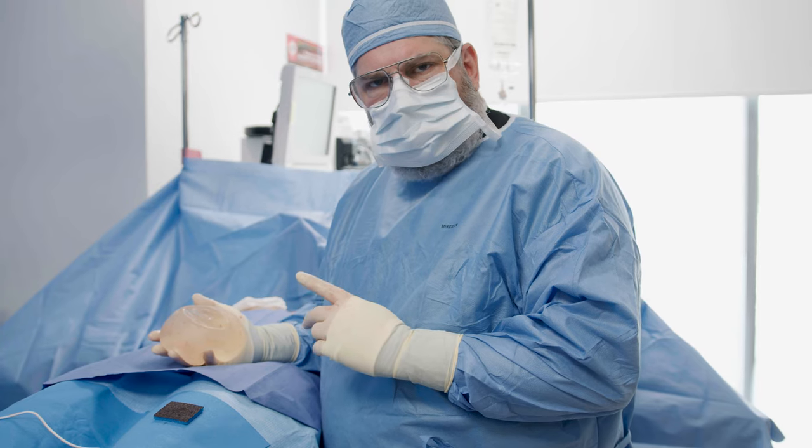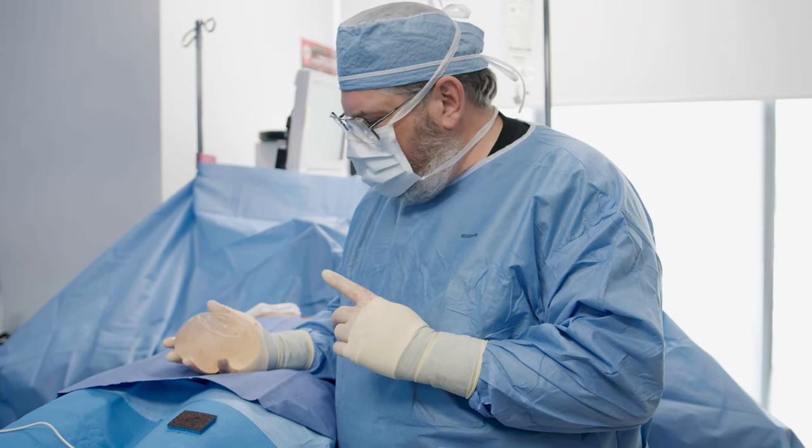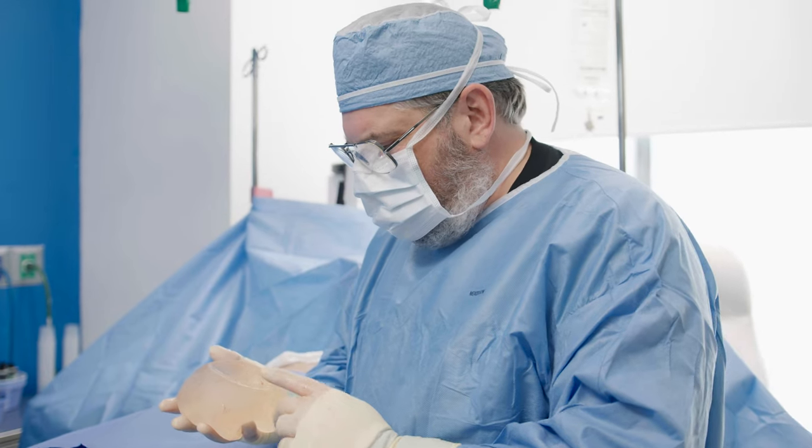She had these implants placed quite a few years ago in Venezuela. I just wanted to show you something because it's a different style of implant than what we use here in North America.